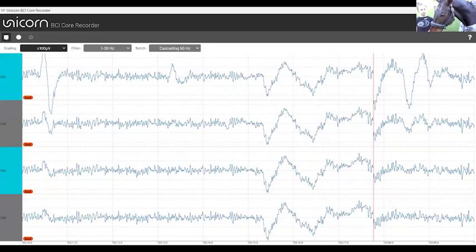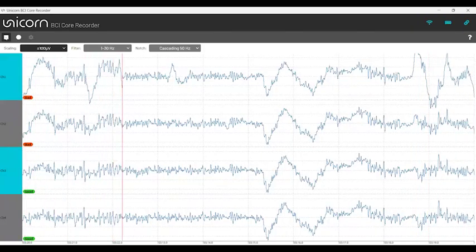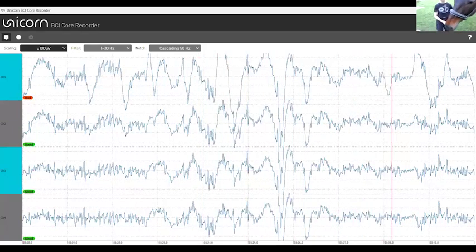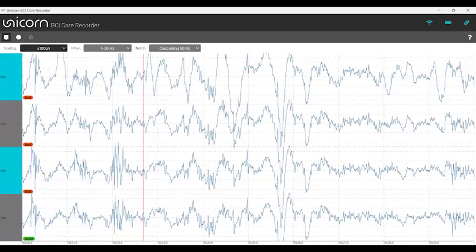Yeah. So this is what we see in this case. Susie, can you maybe feed him something so that we see the chewing artifact? I have a really good crunchy thing. So now he starts to eat.